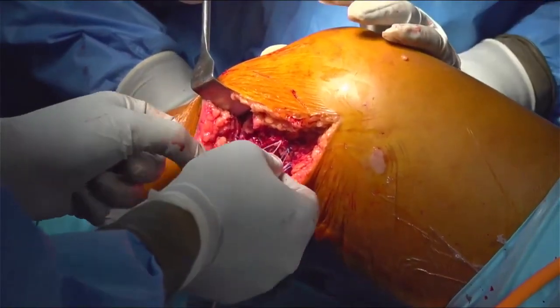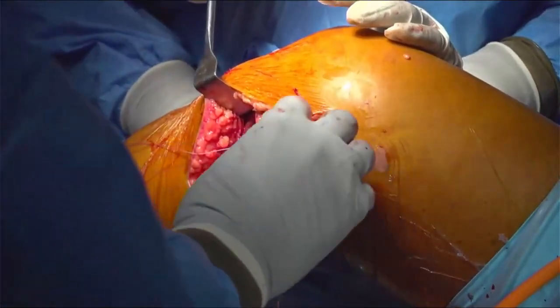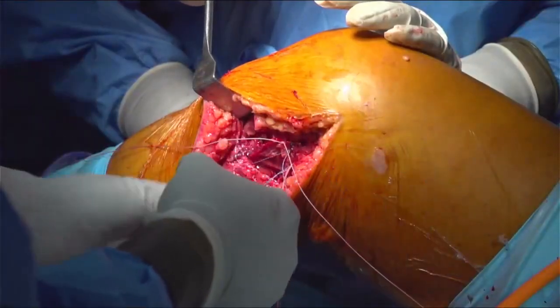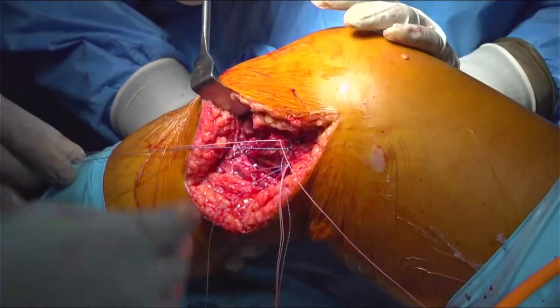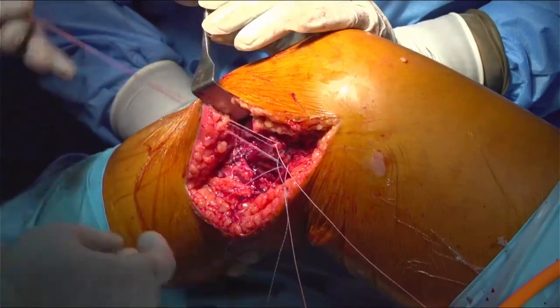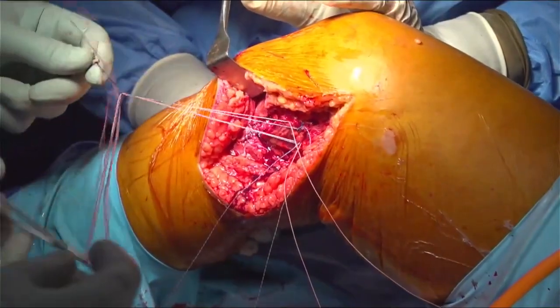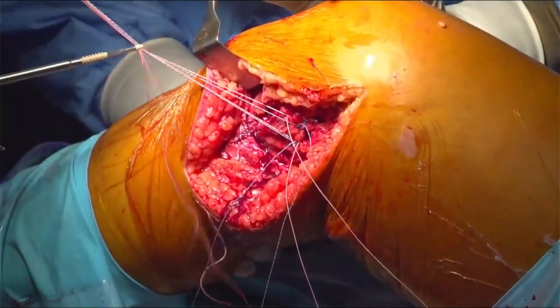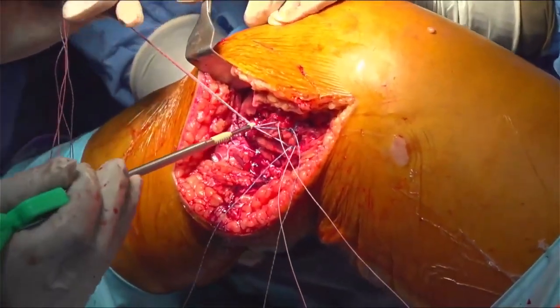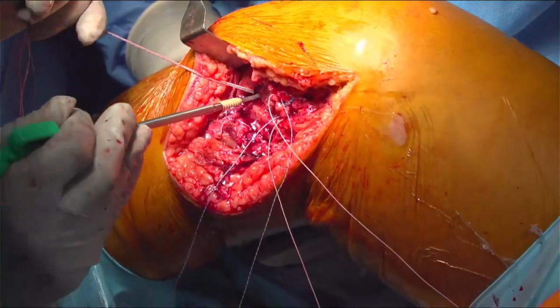1, 2, 3 and 4. I'll put 4 of these into my LR anchor and then repair it anteriorly, because I want to repair my posterior medial or strengthen my posterior medial capsule. Okay, so that's okay. Pull it anteriorly. Give a posterior medial pull. Anterior drawer, please. Yes. And this way, what I'm trying to do is I'm trying to reduce all my.